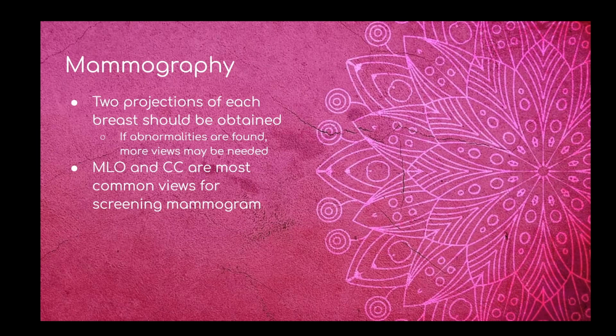Now, we've talked a lot about mammography, and mammography and ultrasound really do go together. They support one another very well. And that's kind of the cool thing about ultrasound. It's a good thing to remember about all of your ultrasounds is that CT, MRI, X-ray are all there to help aid in our diagnosis. If we can't see it, another modality should be able to. So don't stress out if you can't see something, just be honest and do your best.